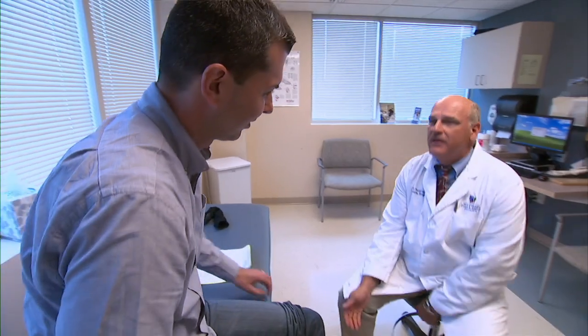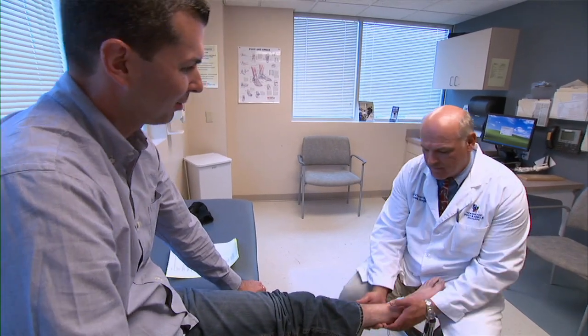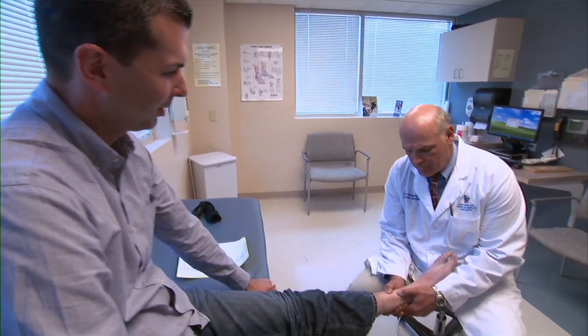Dr. Sloan can attest to the life-changing impacts for his patients who have used this device. He typically prescribes bone growth stimulators in patients that are at high risk for not healing their bone fusion. He notes that each patient is different and the decision to use a bone growth stimulator really has to be made by the individual surgeon evaluating that patient. Prescribed by thousands of physicians to treat more than one million patients, these noninvasive devices may transform patient lives.